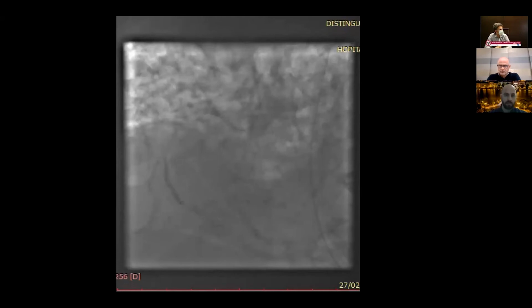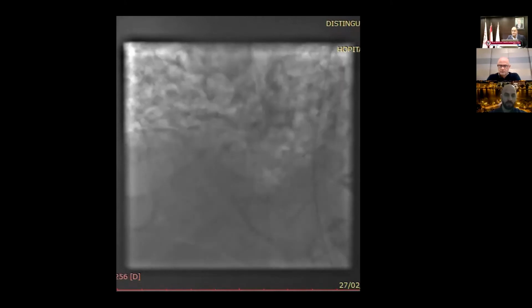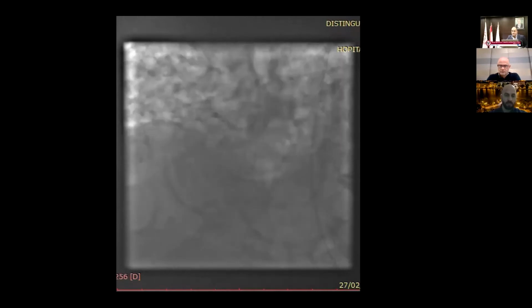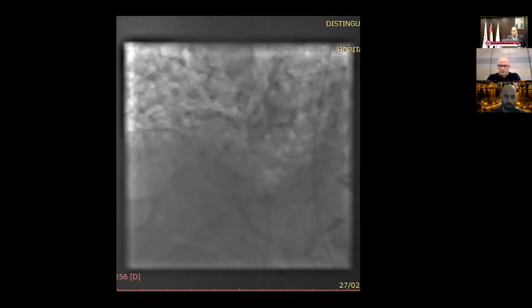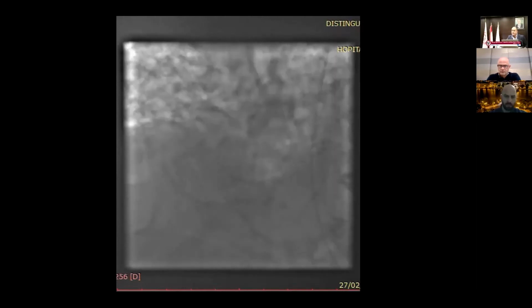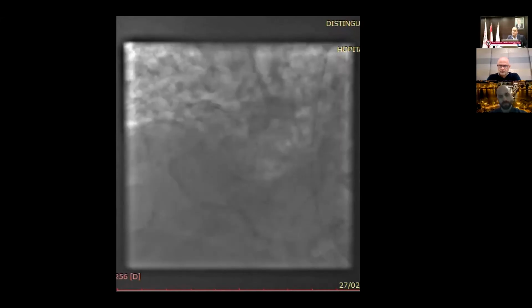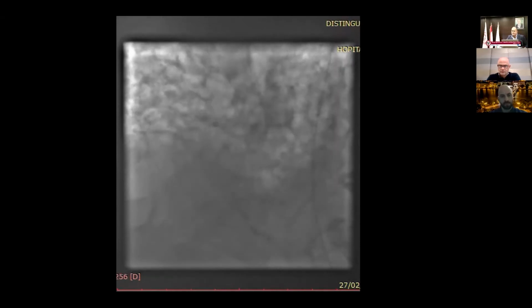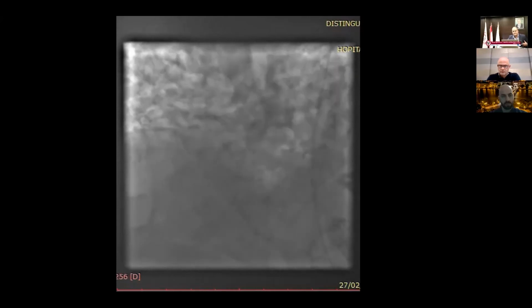So that's why, after crossing of the second wire and injection with the microcatheter, we feel not good about the flow. So that's why I made the final crossing distally to check if we are in the good lumen or not. And we noticed the calcium at the entry of the ostium of the RCA, which we can notice from the beginning of the procedure.